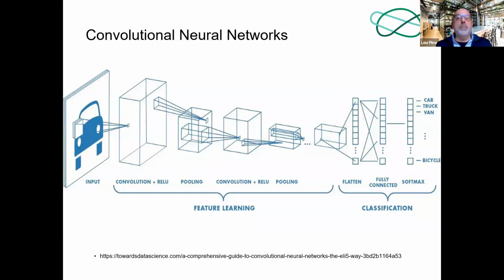So this is computationally expensive and time consuming. So deep learning methods need a lot of computing power. An example is that you need a stack of GPUs, and now there are a lot of cloud providers offering cloud solutions that will give you the computing power that's needed to train these networks. They also need a lot of data.